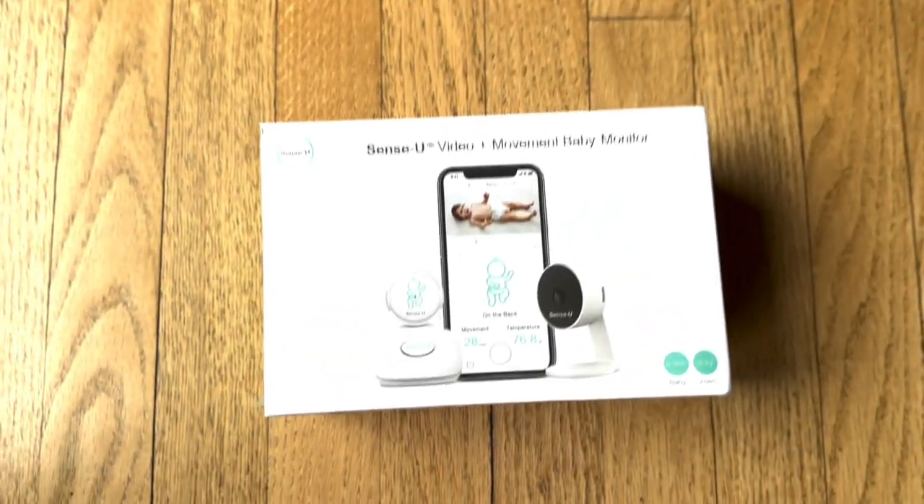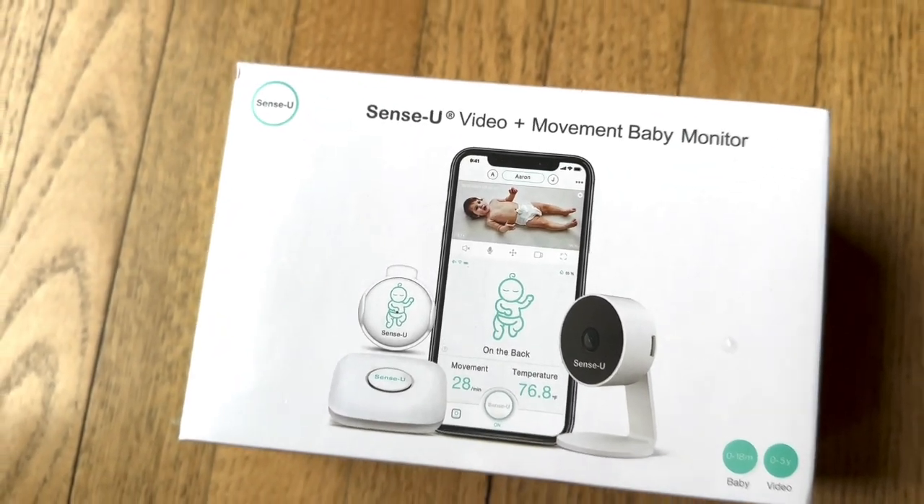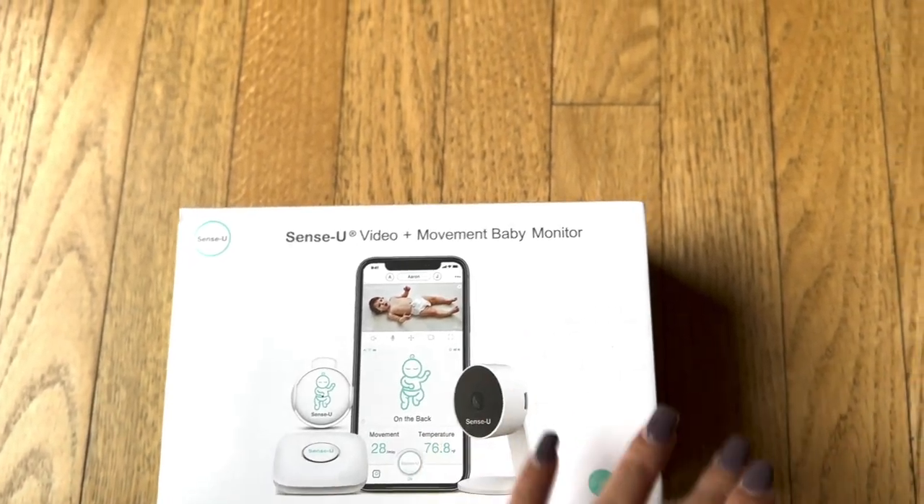The quality of everything is just great. I've been using it for a while and both me and Richard really like it, so we thought we would share this with you guys. I'll share what all came in the box, how we set it up, and what to do. This is the Sensu Video Plus Movement Baby Monitor, and we will unbox it — but before that, let me give you an overview.